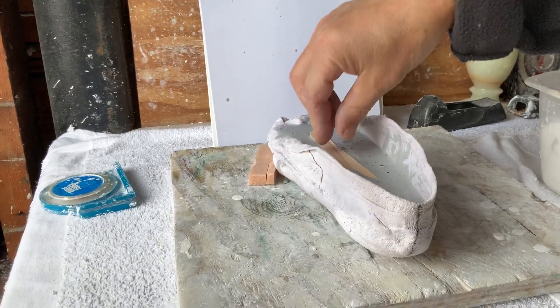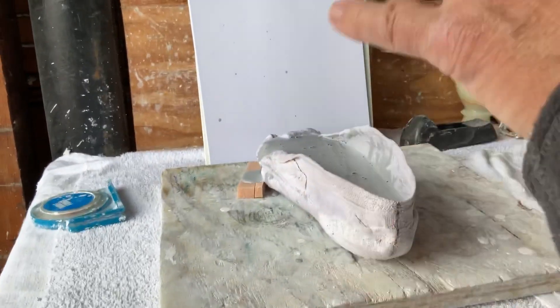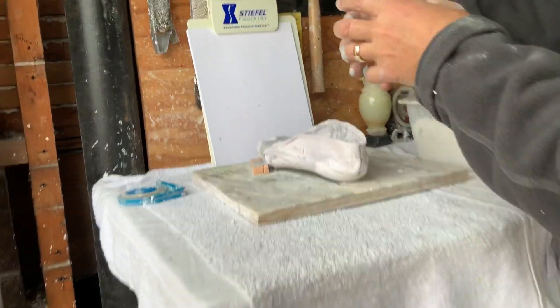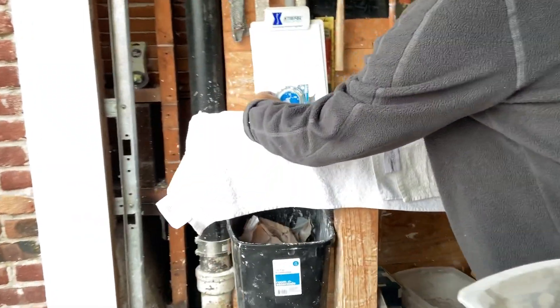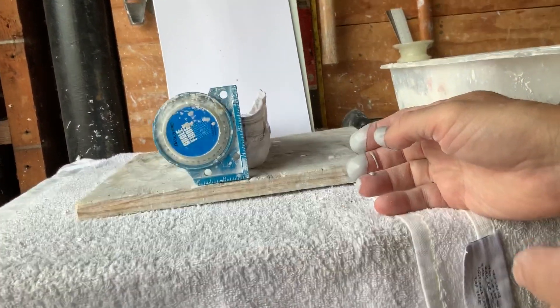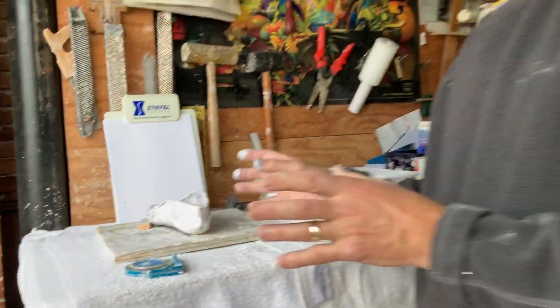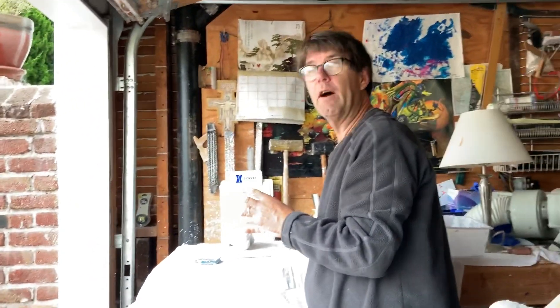I take splints of wood — these are old tongue depressors — and push them down so that when I press it, it's also harder for it to break. Then of course you want to recheck your line to make sure it's vertical to the heel. This is how you pour a negative cast that will become a positive cast. Tomorrow we'll go through the steps of making a positive cast and starting the correction on the feet that we want to accomplish. Thank you.